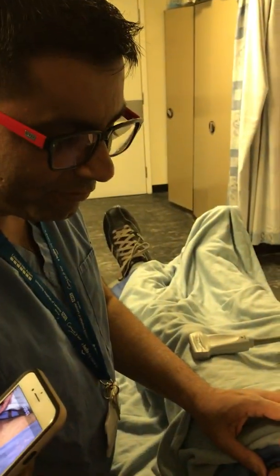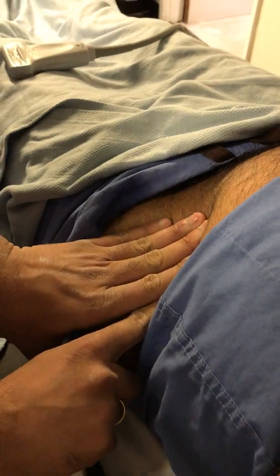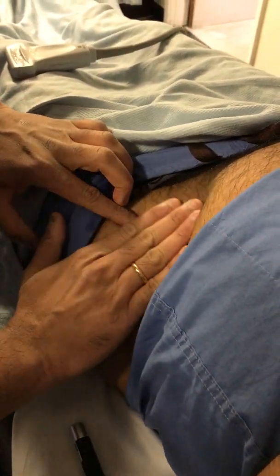We'll do the sort of feel for the ASIS, anterior superior iliac spine, four finger breadths below the anterior superior iliac spine — and that's four finger breadths.